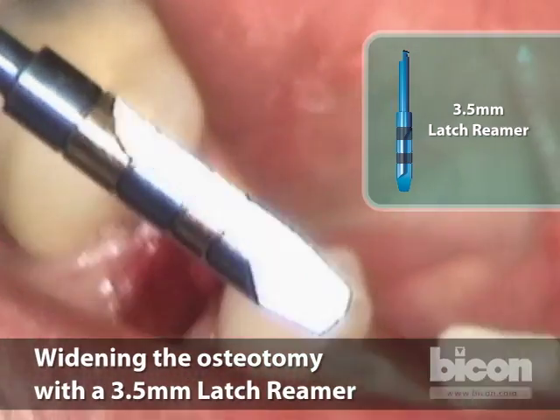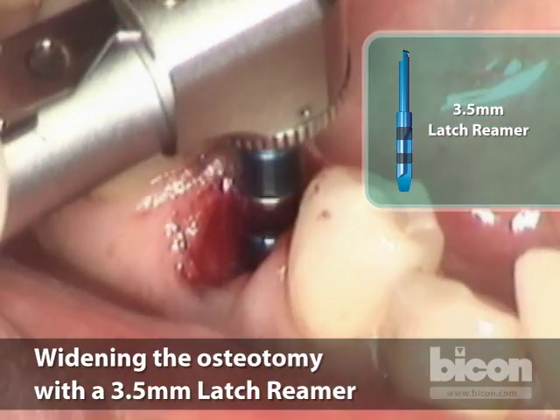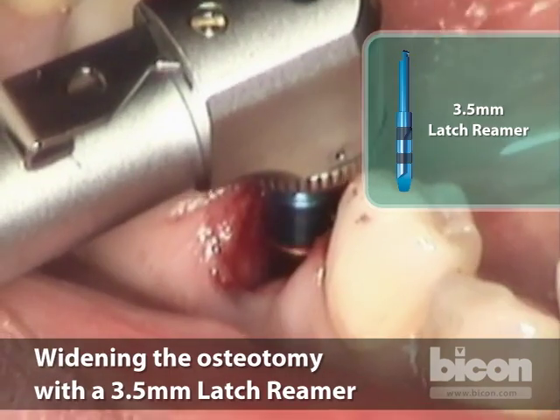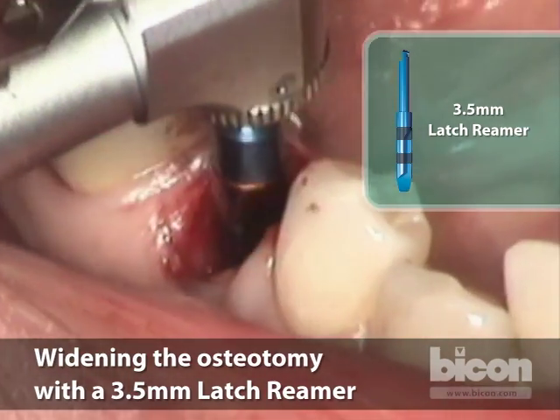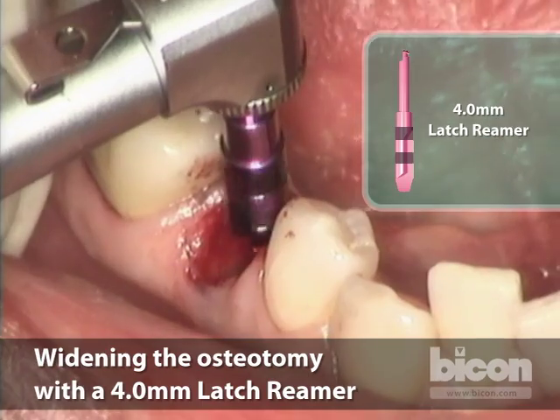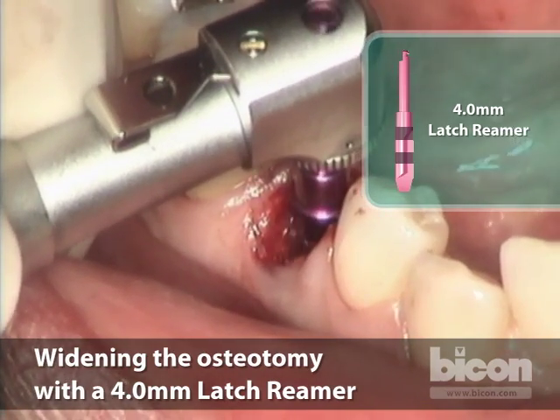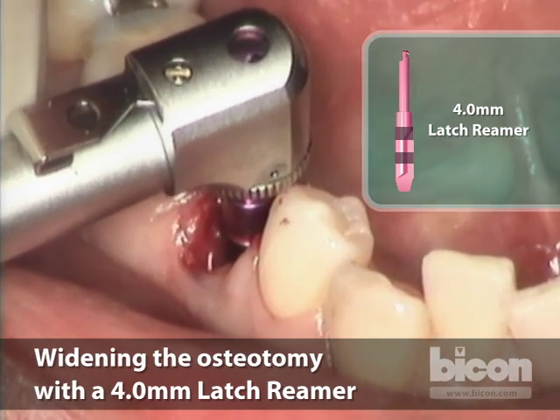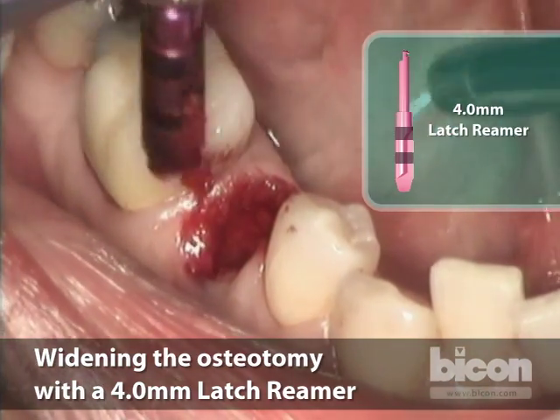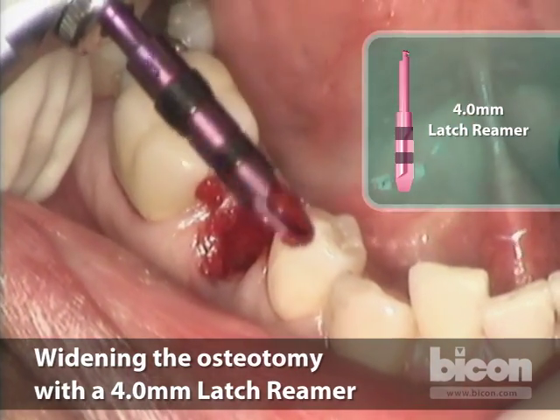The 3.5mm reamer has the same bands, accentuated by grooves which make it easier to see where you are reaming. Because of the slow reaming of the Bicon implant, these reamer drills can last up to 200 implant placements. We are now at four millimeters — they're all color-coded. It goes in pretty quick succession and is very logical: if you're placing a four and a half millimeter implant, you ream to four and a half; if placing a five, you ream to five. As we engage the walls of the socket, we're getting more bone, and all of this bone is collected and harvested.